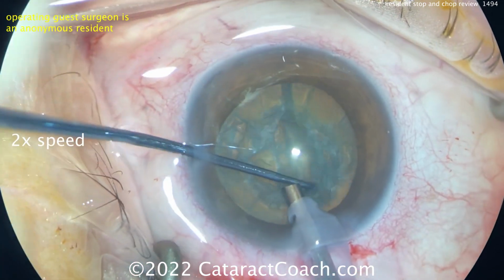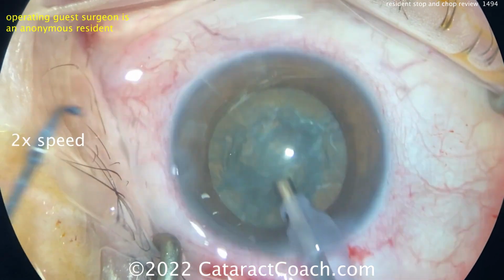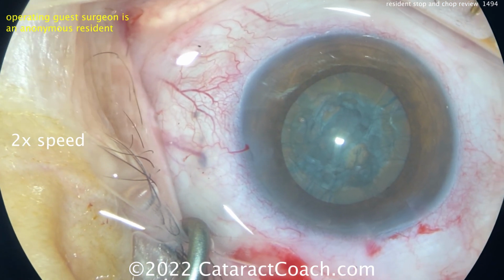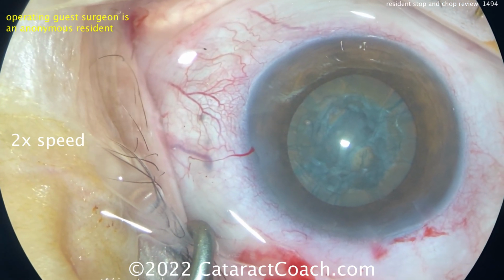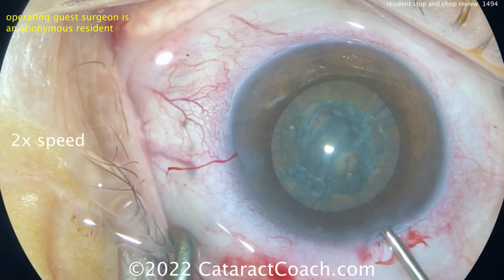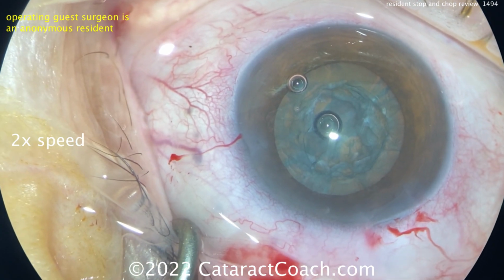And now, beautiful split. Very nicely done. I also like that the draping is pretty good, all the lashes out of the way. I like the incisions. Nice. I like the rhexis looks good. This is a nice looking case so far. Not sure why the doctor came outside the eye here. Let's see, putting in some more viscoelastic perhaps.